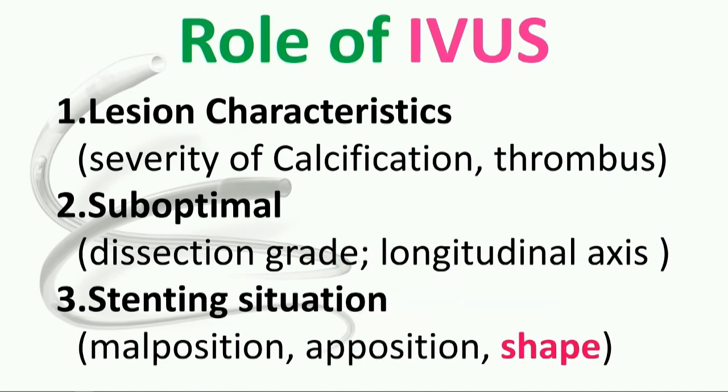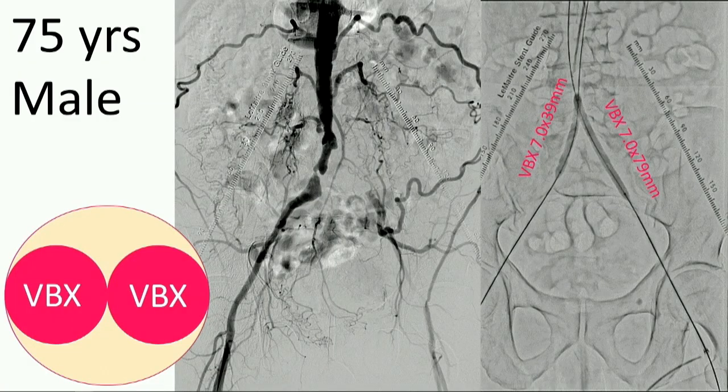The shape is very important for aortic occlusion, especially at the bifurcation occlusion site. If you put a balloon-expandable stent, not a self-expandable stent, at the terminal aorta, you can put it like this. I put it so it covers the bifurcation like this. In the aorta, the bifurcation is at a position where it's observed like this, so the restenosis rate is very, very low. Therefore, it does not matter for many patients, but I care about this situation.